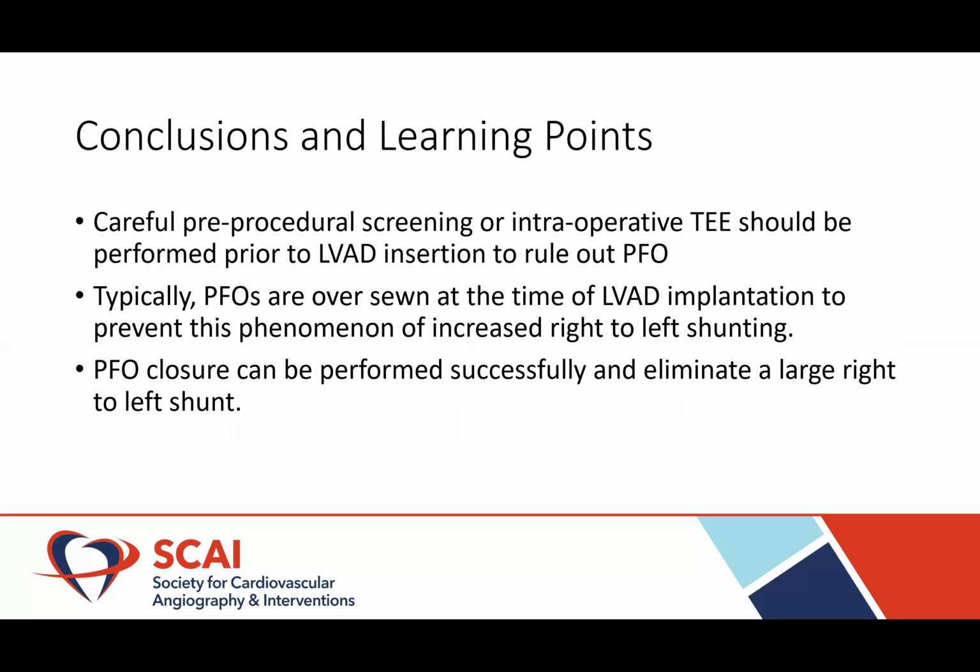So the conclusions and take-home points from this case are that very careful pre-procedural screening and intraoperative TEE should be performed prior to LVAD insertion to rule out a PFO. Particularly in this case, there was a retrospective review of the intraoperative TEE, and there really was no PFO that was seen at the time.